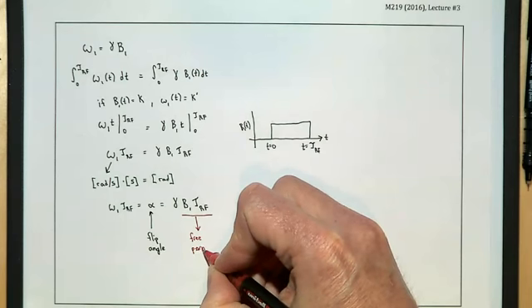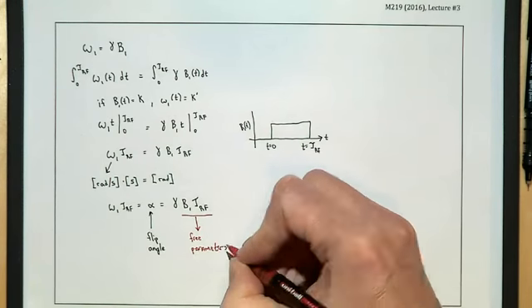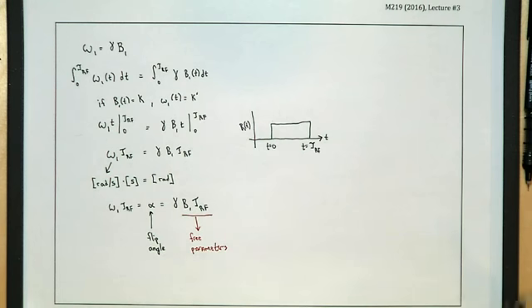So when it comes to designing your first RF pulse, if you know what flip angle you want, then you just have to know what your gamma is, and gamma can change, right? You could design an RF pulse for carbon-13, no big deal. You could do it for 31P, just as hard. All you need to know is what's your product of B1 and tau RF, and then you can, of course, calculate the resultant flip angle.